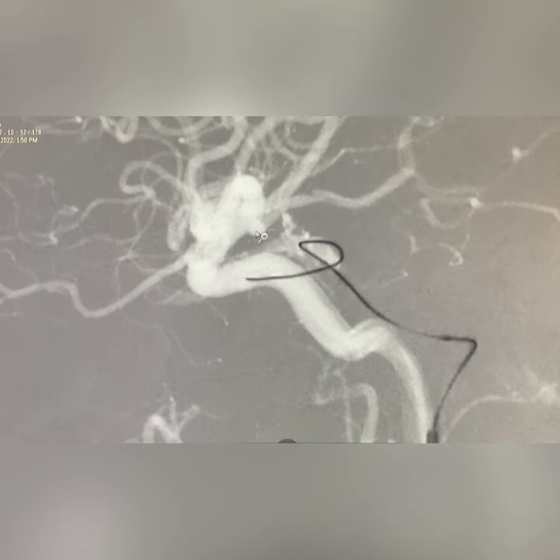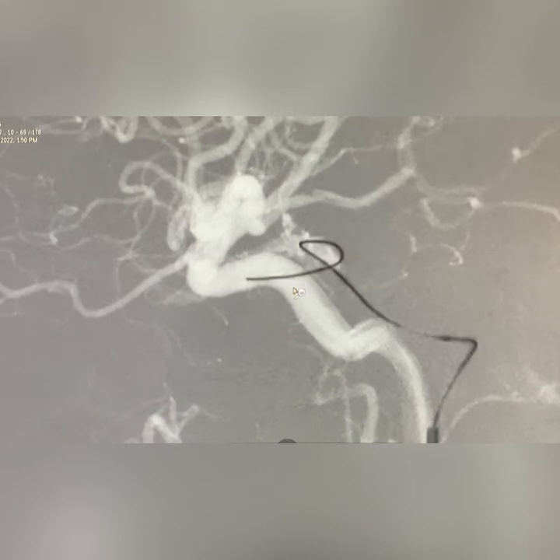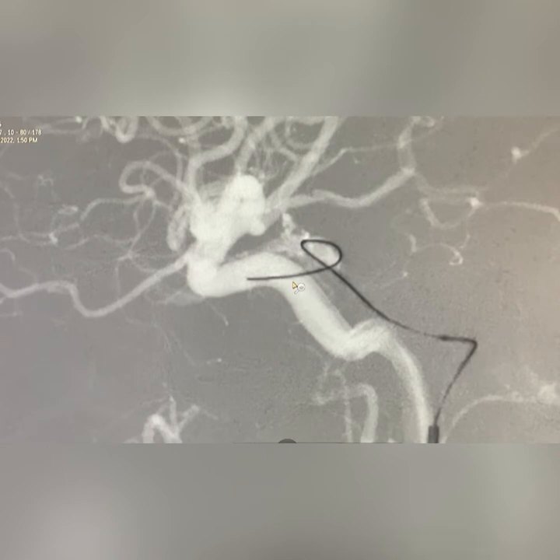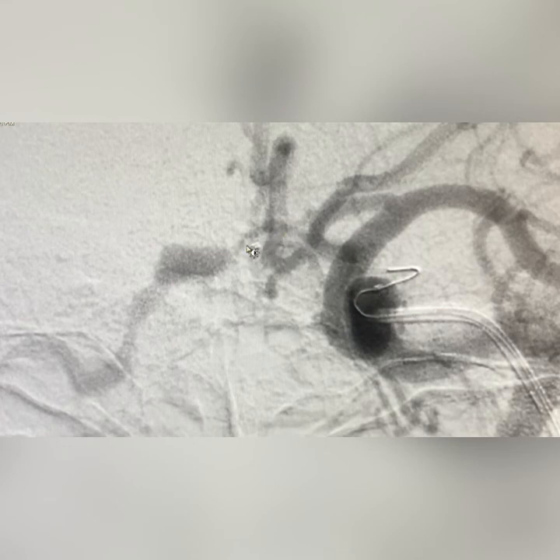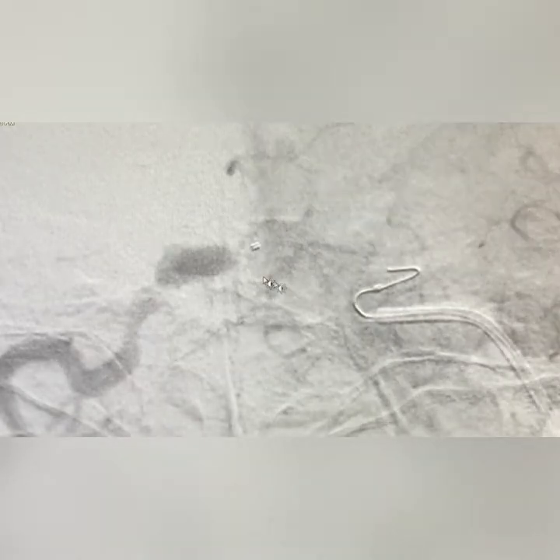We prefer the Echelon (acylon) microcatheter because it is DMSO-compatible, allowing injection of both coils and Onyx. We navigate inside the cavernous sinus with the goal of completely occluding it. A challenge arises when there is no inter-cavernous connection, meaning both right and left sides must be approached separately — from the right side and left side. As seen here, our diagnostic 5-French vertebral artery catheter is in position and the microcatheter has advanced into the cavernous sinus. We are attempting to reach the contralateral side, but facing challenges. So we will embolize the ipsilateral left cavernous sinus first, then reapproach from the right side.